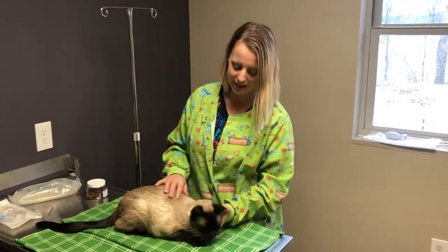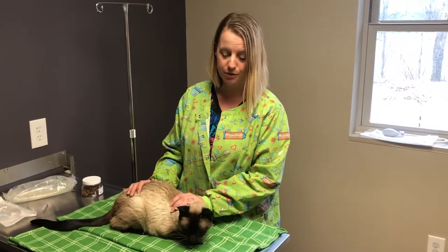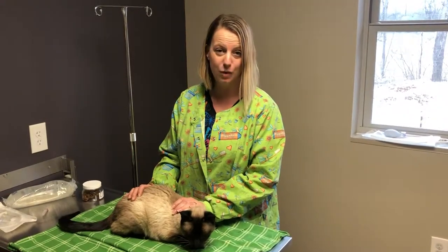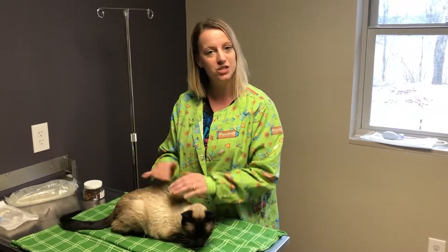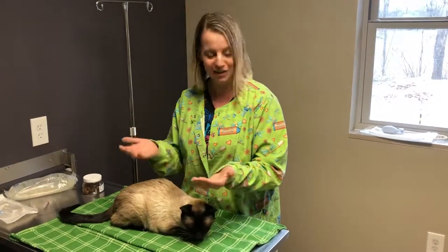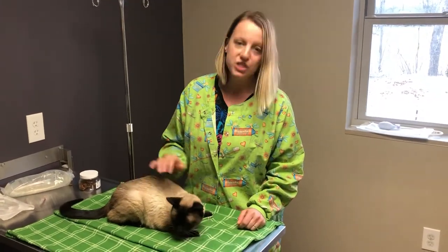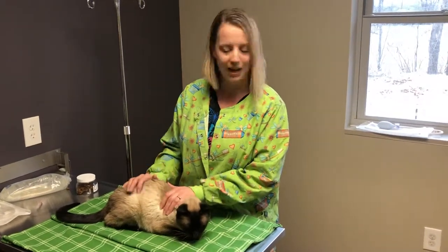Hi, my name is Stephanie and this is Chico, and today I'm going to be showing you how to give subcutaneous fluids. Sometimes in cats and dogs your veterinarian might send you home with fluids that you have to give at home, and it's subcutaneous which is underneath the skin. Chico's a little dehydrated so we're just going to do it in the clinic — the owner doesn't have to do it at home for right now.